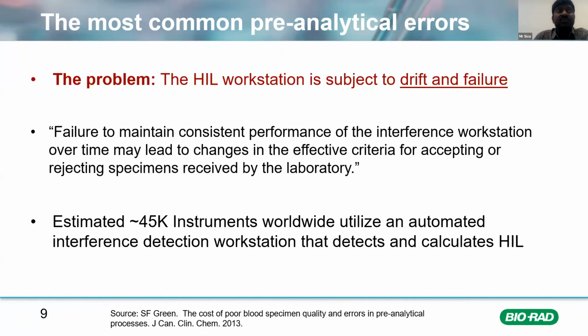When you have such sophisticated, advanced, cutting-edge equipment provided along with HIL detection solutions, why does this question come up? It comes up because the HIL workstation is also subject to drift, and also subject to failure.